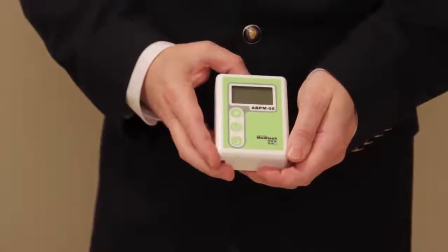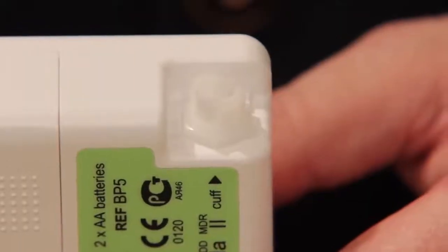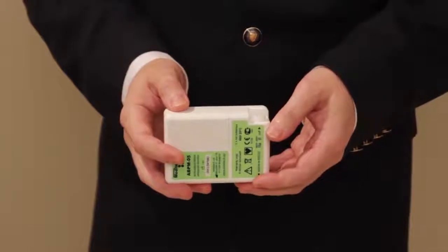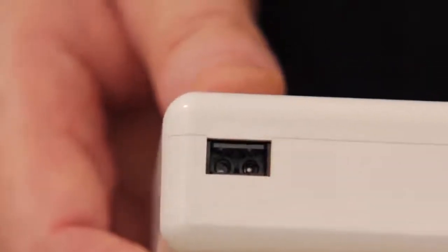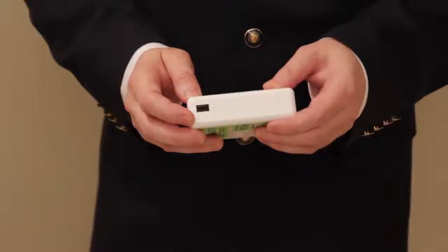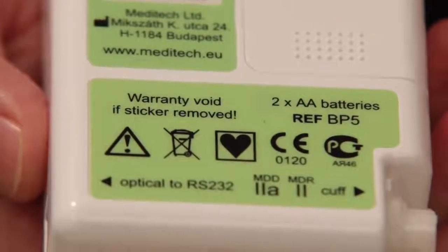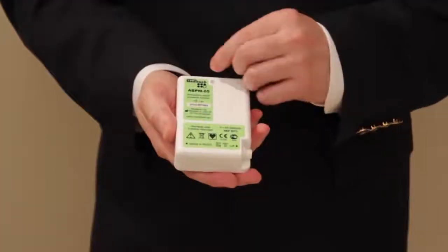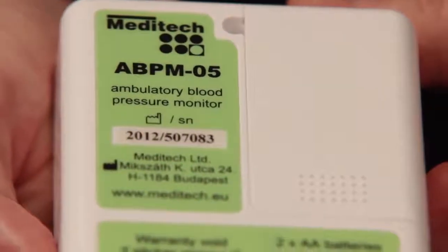The device itself has 2 major connection points. One of them is right here. It's where the cuff is connected with its tubing. The cuff is an upper arm type cuff. And on the other side, right here, is a connection for the computer cable, the optical USB cable. On the back side, this is also indicated, the cuff connector and the optical connection to either a serial port or a USB port. There is also some information on the rating plate of the device, including the serial number.